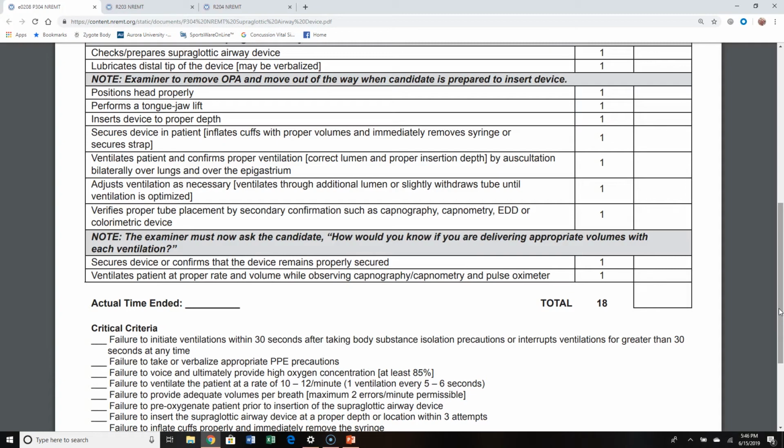You wrap it around the patient, and you put the tube into it. It's got a little screw grip hold point that essentially holds the tube in place and keeps it very, very stable. If you've watched medical shows, that's usually the blue little plastic mouthpiece you see the patient wearing, and then the tube comes out through the center of it.